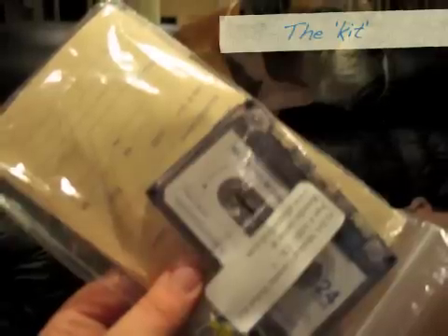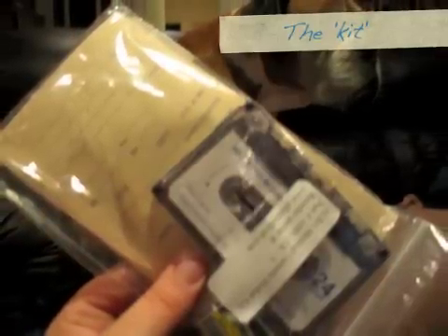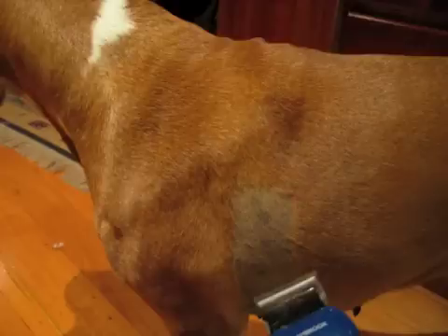Each time you do a recording, you have to use a kit. The kit in front of you on the screen is an analog kit, so it's got a tape. You need to prepare the contents, take the tabs off things, write the dog's details on the diary and on the tape and the date.